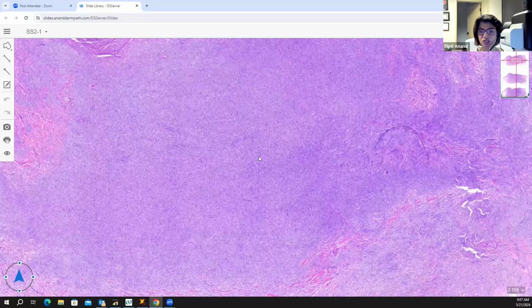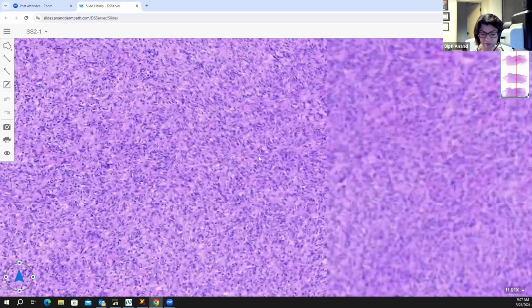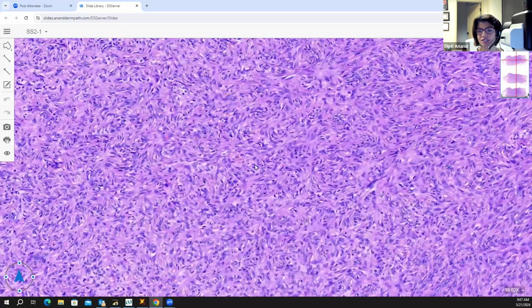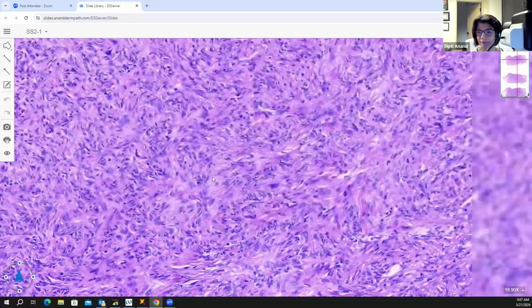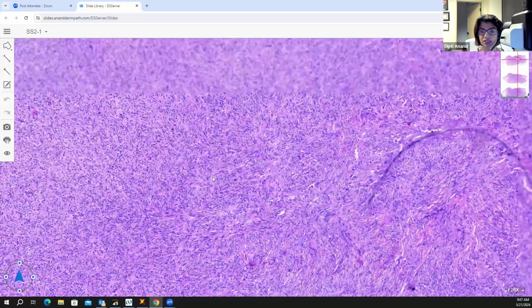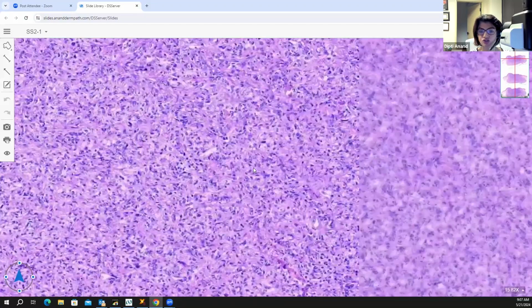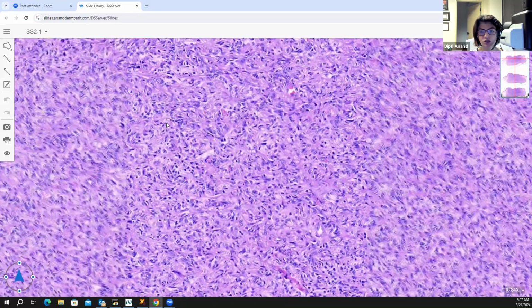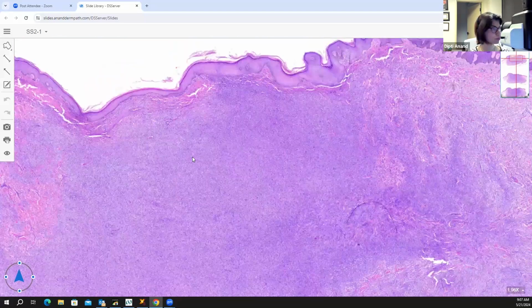Yeah, so this is actually a cellular or xanthomatized DF. It's a pretty big lesion, but it's completely benign. You can see here there is a swirling kind of pattern, but admixed, if you look closely at the lesion, there are also inflammatory cells, histiocytes, and giant cells. All of that is indicative of a benign process. So this is a xanthomatized or big giant dermatofibroma.